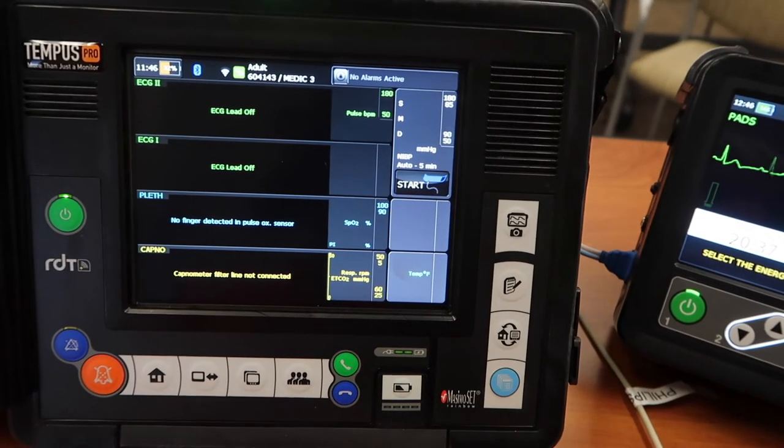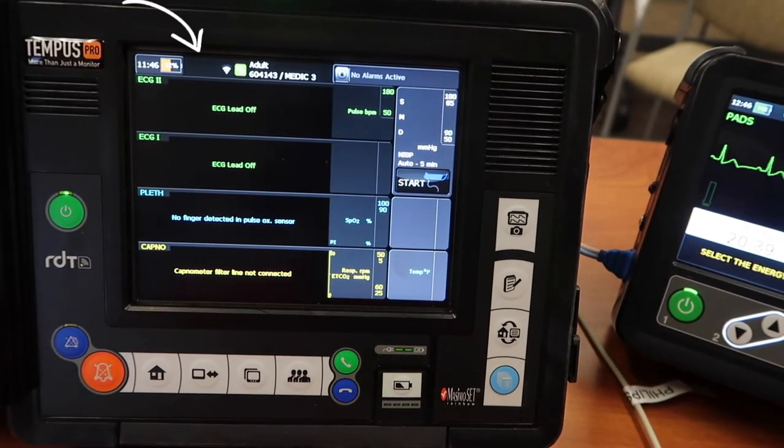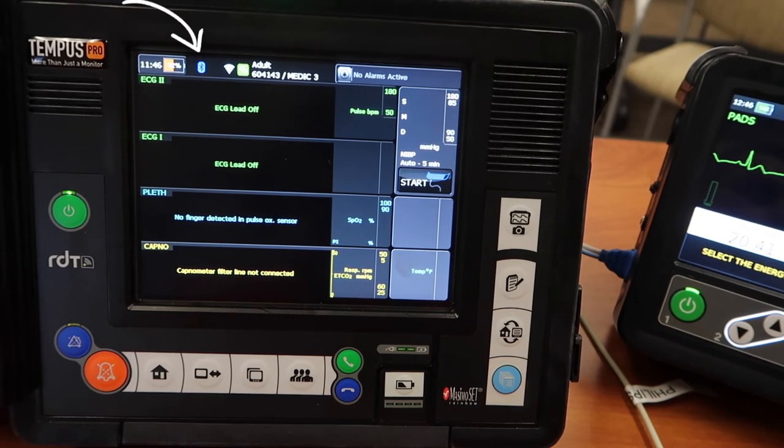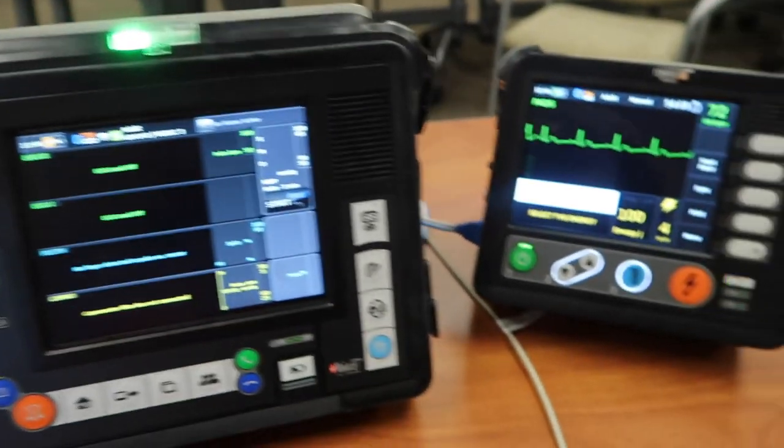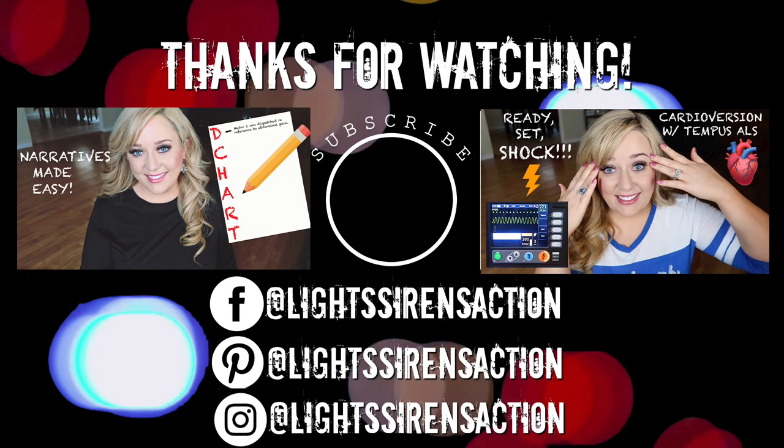So they are looking for each other and attempting to pair, and it really doesn't take that long. Once they've paired, you will hear a dinging noise confirming the pairing has authenticated. And now you know that they are paired and communicating with one another.